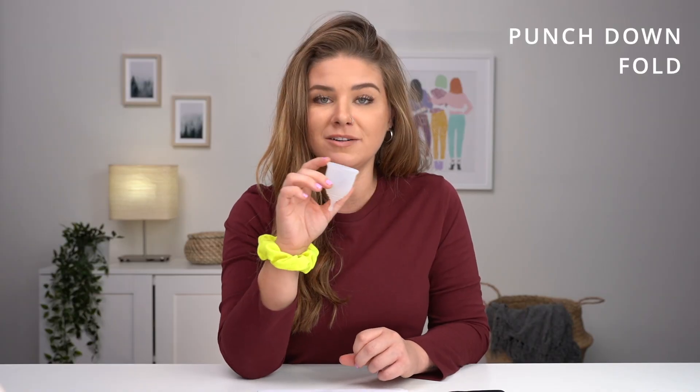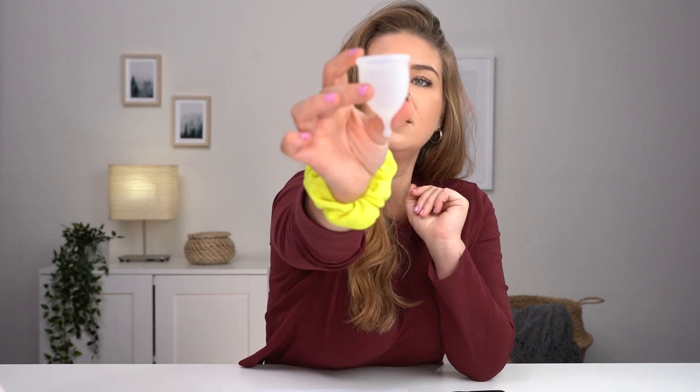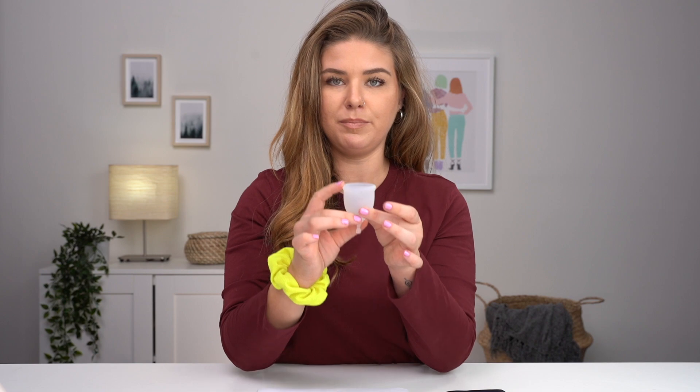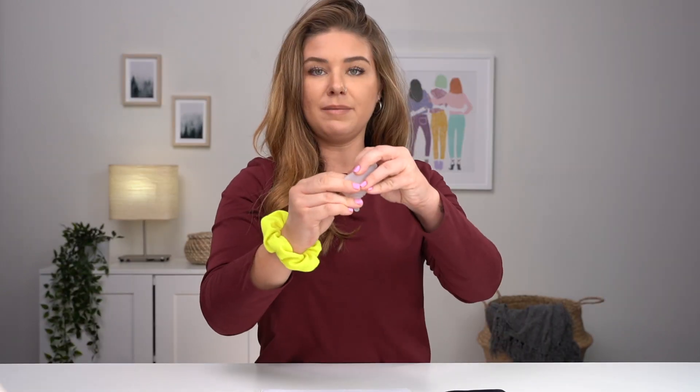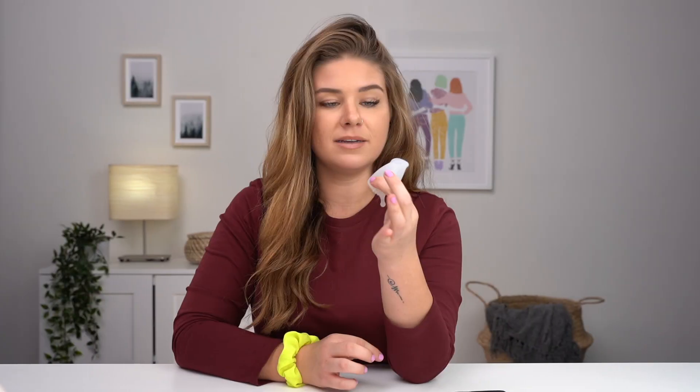So you bought a menstrual cup and now you're wondering how do I put this thing in my vagina? The easiest fold for beginners is this one — it's my personal favorite. You put your finger on the rim and then you punch it down and grab the base like this, so it looks like this. It makes the smallest point of entry, so it's really easy to insert, and then once you get it in, just release. If you end up pinching your cup in your non-dominant hand — which is my left hand — switch over to your right so that you have more control when inserting it.